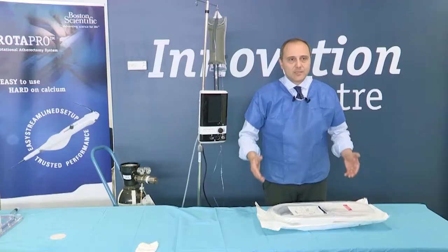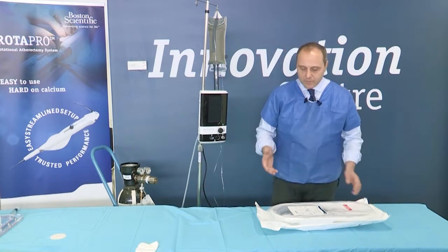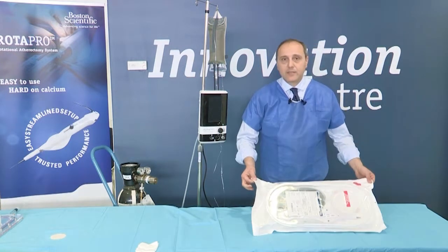We are ready now to start our procedure. Let's set up the system step by step. Here I have with me a completely new Rotablator Pro.